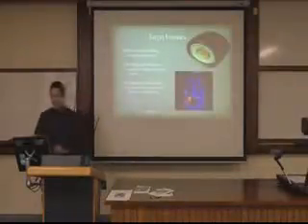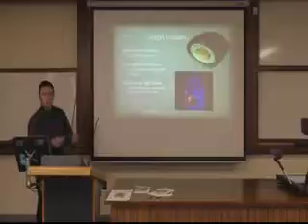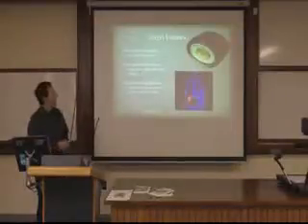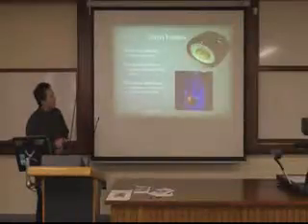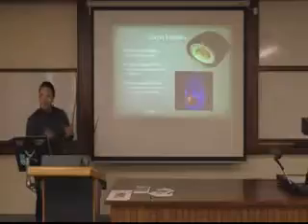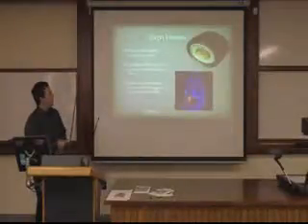So with radiotherapy, there's 3 volume definitions. The GTV there is the gross tumour volume. That just sounds like what it is, the gross tumour. And the clinical volume accounts for little microscopic invasions of the tumour around there. And then the planning target volume is what my research is focused on, which is margins that are added to account for patient setup errors and intra-treatment motion.